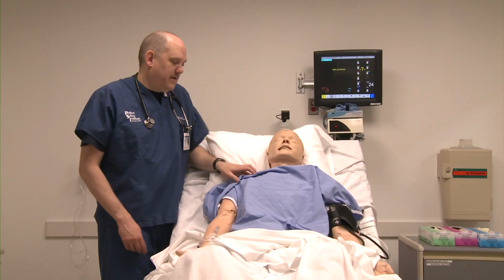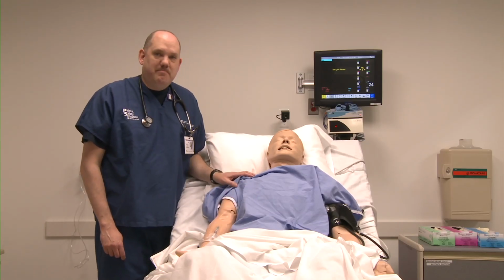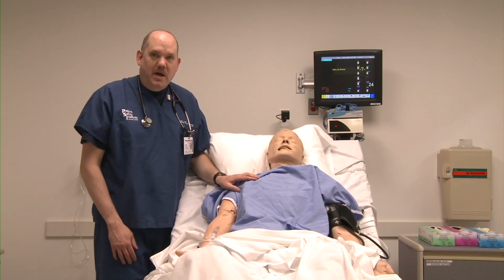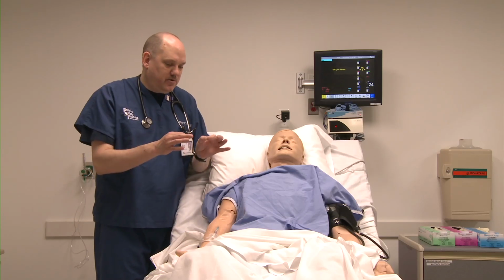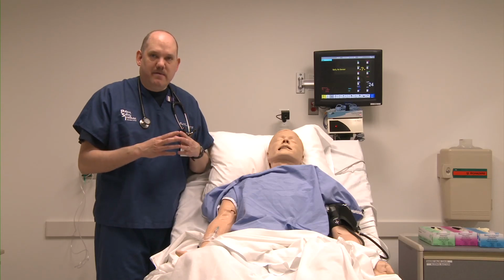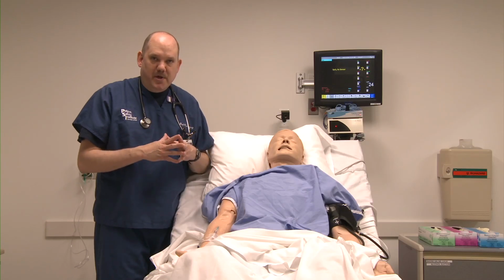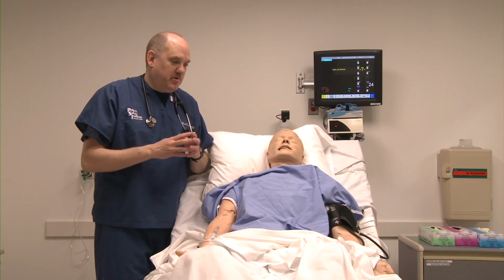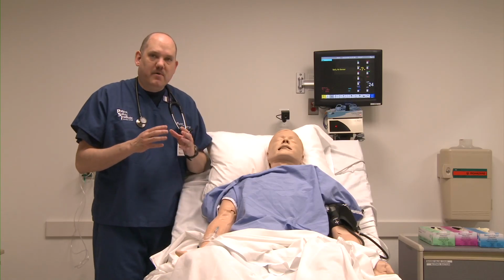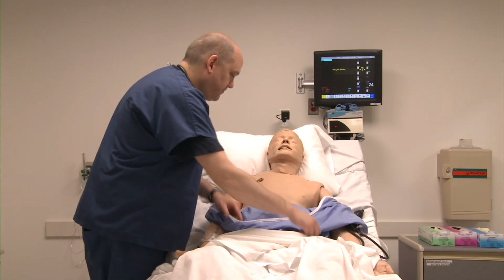Let's turn our attention now to SimMan's chest and abdomen to auscultate his heart, lung, and bowel sounds. The sounds that SimMan can produce are realistic. However, they are transmitted through tiny transistor radio speakers. What that means for us is that unless we have the diaphragm of the stethoscope located precisely over the speaker, we might not be able to hear the sounds very well. So it's very important that you pay attention during this section to see where to put your stethoscope for optimum listening pleasure. Let's begin by exposing the chest.